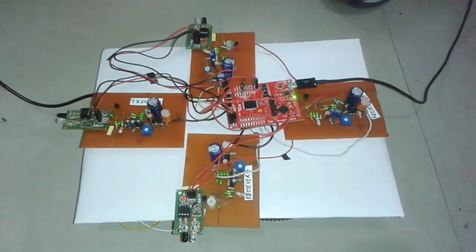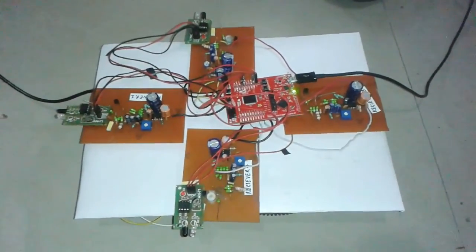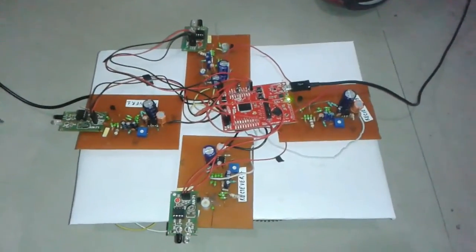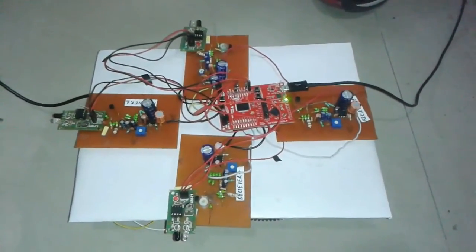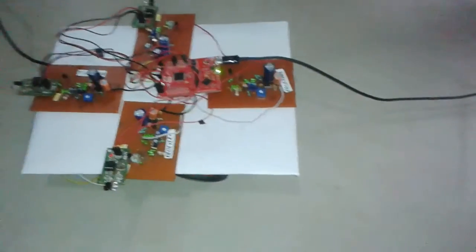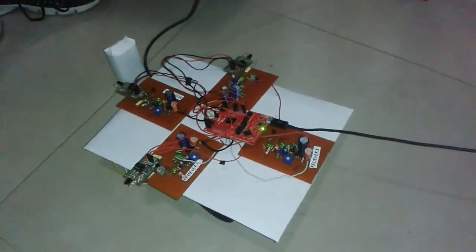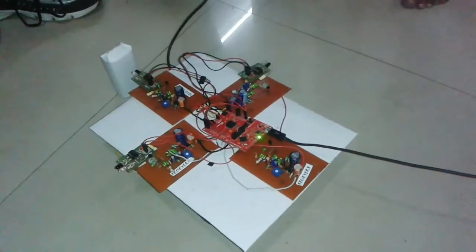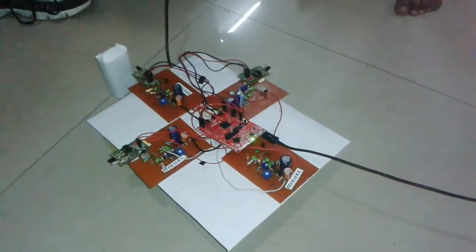Phase 1 of the project is the calling of the wheelchair. In this phase, the wheelchair is called by the disabled person when the emergency alarm goes off. The person switches on the handheld transmitter and the wheelchair tracks its way to the person with disability. The overall system employs a complex algorithm of comparing the receiver signal levels and moving the robot in the direction computed by the algorithm, in the same manner as the board shown in this demo video.